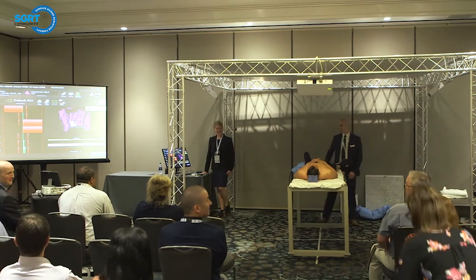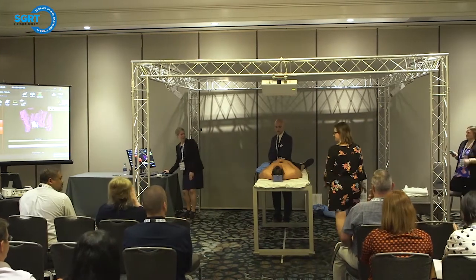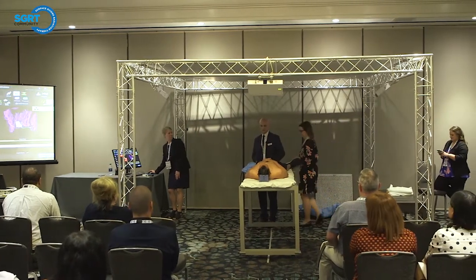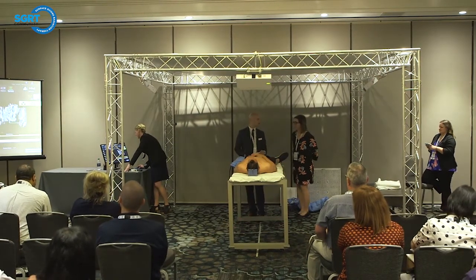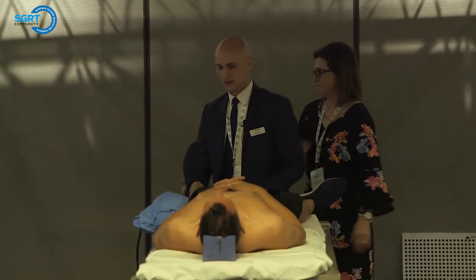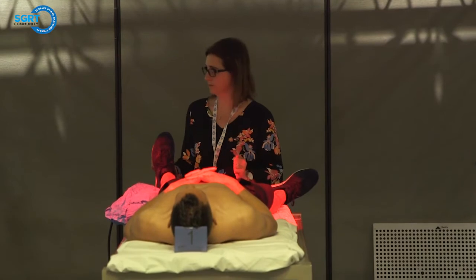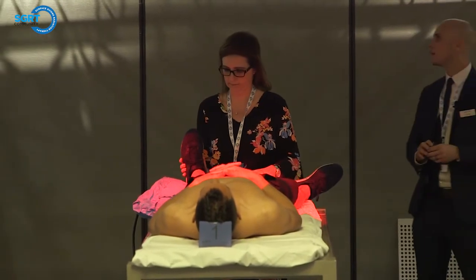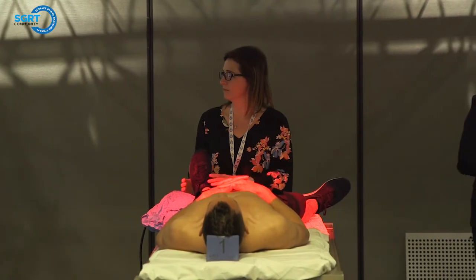Come on up. Go ahead and take another reference. Go ahead and bend your knee. Relax. Okay. We're just going to give you a fresh start. Is that okay? Okay. All right. We'll go ahead and start monitoring and then start the timer now. Oh, man, I didn't even move him out. See, sometimes I make it easier than I should, right?